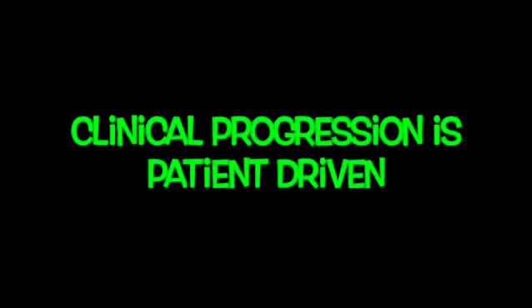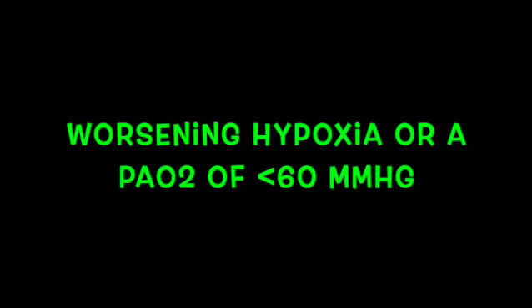NIVST does have its limitations as the patient's condition worsens or the disease process unfolds. Non-invasive support may no longer be an option. The following are signs that the patient is failing NIVST and the provider must take action: decreasing LOC, physical exhaustion, worsening respiratory drive impairment, worsening hypoxia in the presence of 100% FiO2 or a PaO2 less than 60 millimeters of mercury, and increasing CO2 retention of 55 millimeters of mercury or greater.